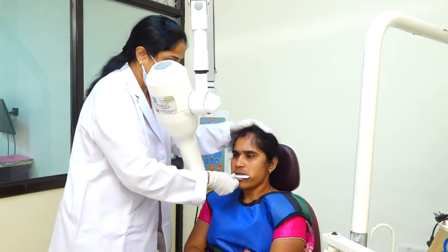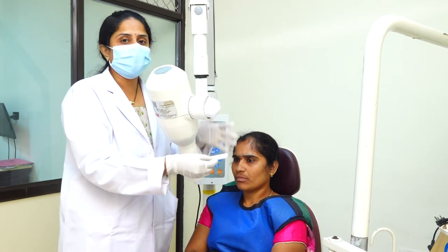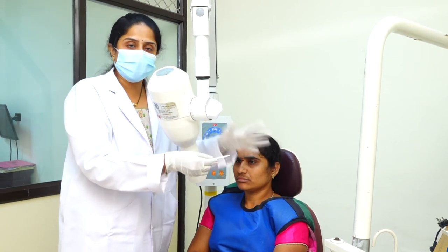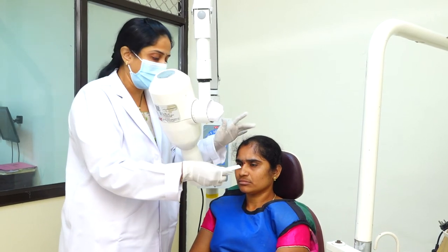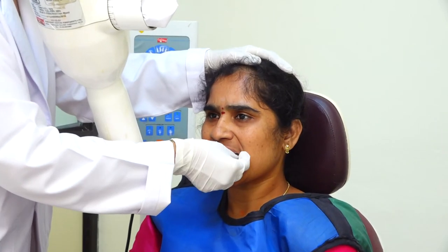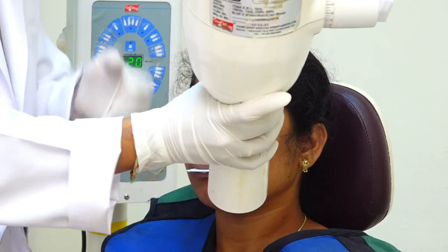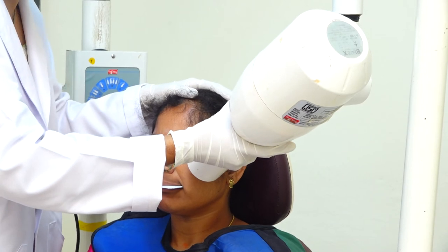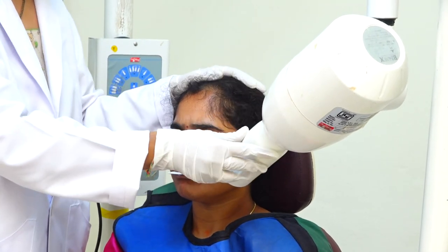Coming to the lateral maxillary radiograph, we will place the film on the side of interest, either right or left depending upon the patient need. I am showing now for the maxillary left lateral radiograph. Here, the long axis of the film should be parallel to the sagittal plane. Ask the patient to open the mouth, place the film on that side, and ask the patient to bite. Change the angulation to plus 60 degrees and place the tube on that side. The central ray should be 2 centimeters below the lateral canthus of the eye.